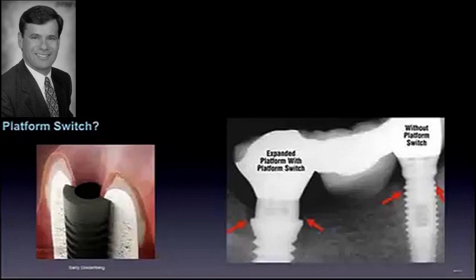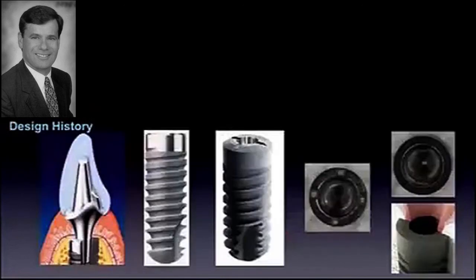So when you say that, you need to look a little at the history, because the history of this implant is quite interesting. It was developed by Degussa in Germany in the mid-80s. And the original design, up until even the turn of the century, was different. And it was actually thought of differently. It had a polished collar, a polished platform. It was positioned either at the crest or supracrestally. The interesting thing was that a lot of folks were placing these subcrestally, like any implant.